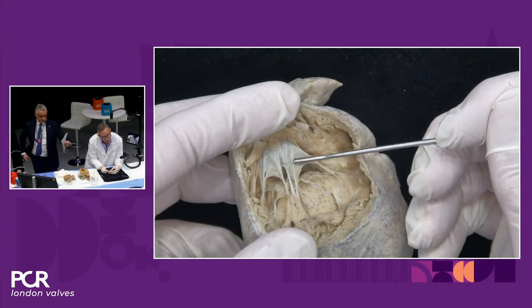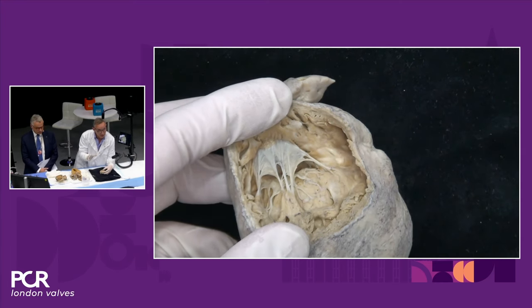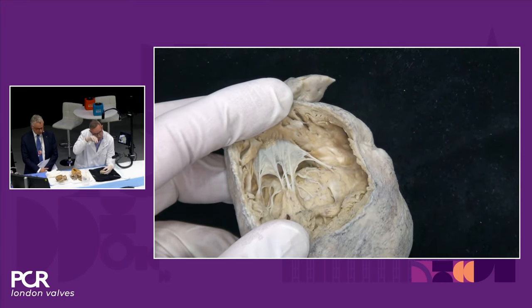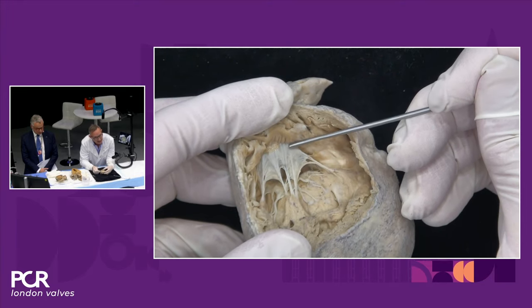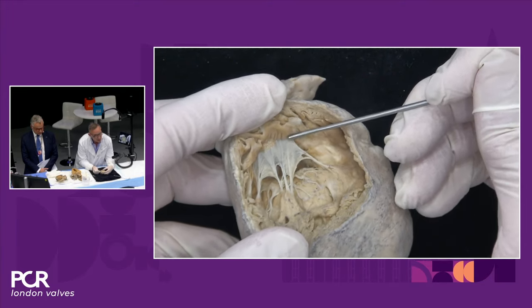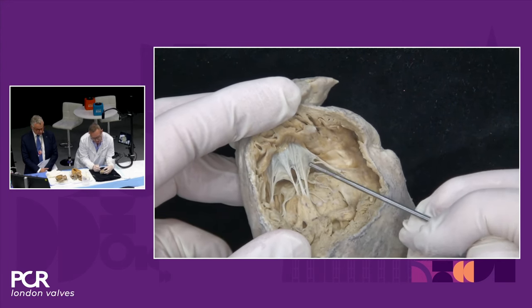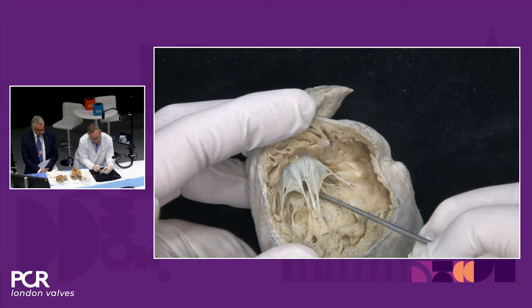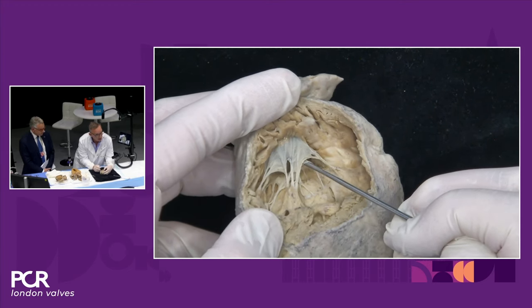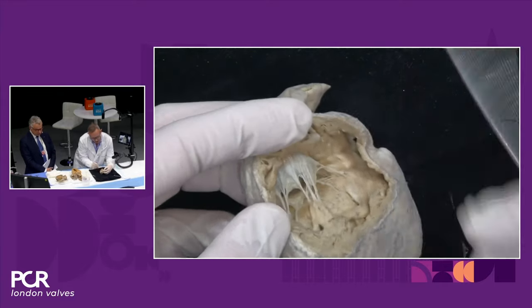You can see that cords are running up here and joining onto the annulus. This is a sort of webbed arrangement. The valve is thinner, so we're able to see those cords, and you can see the structural integrity of the valve supported by those cords. So the easiest clip, as you say, is between this region here, the anterior leaflet, and the septal leaflet underneath. That will then reduce the orifice and reduce the regurgitant jet.